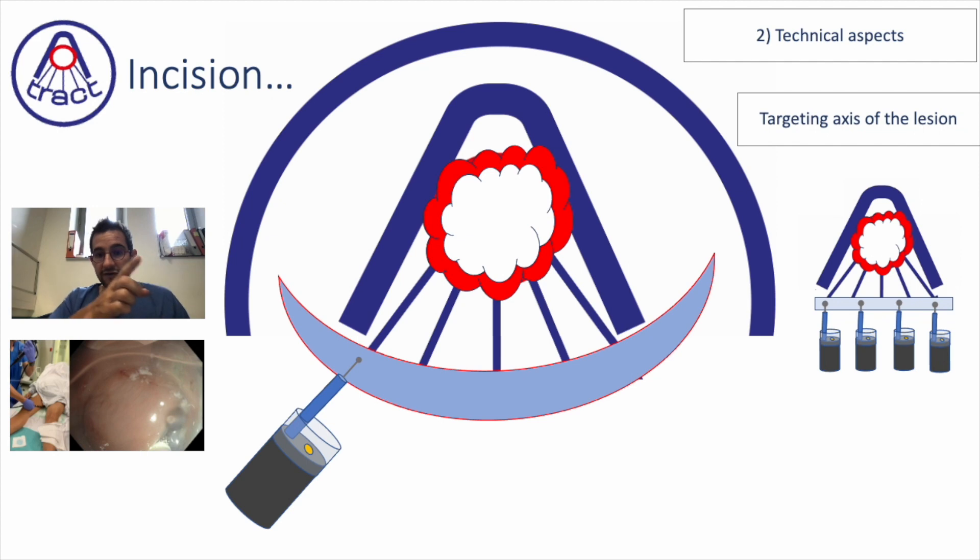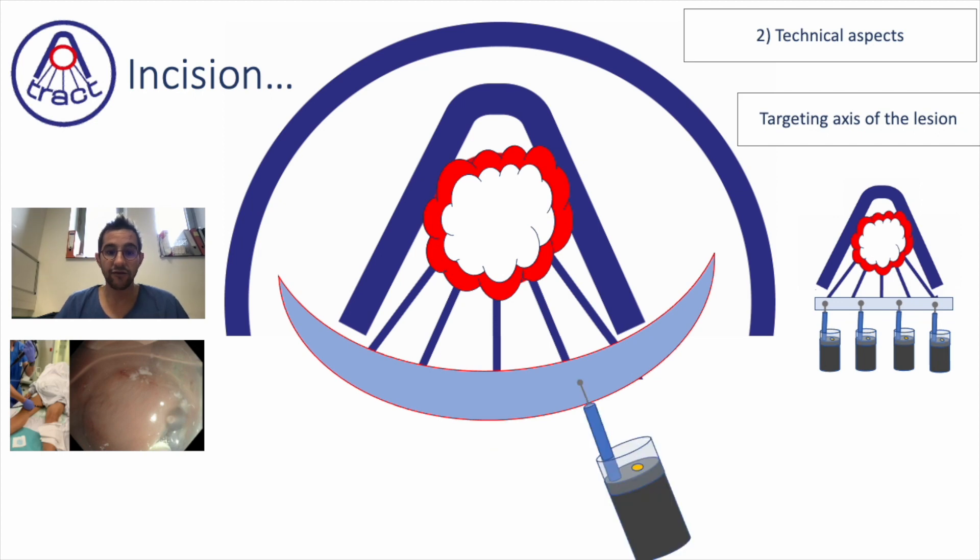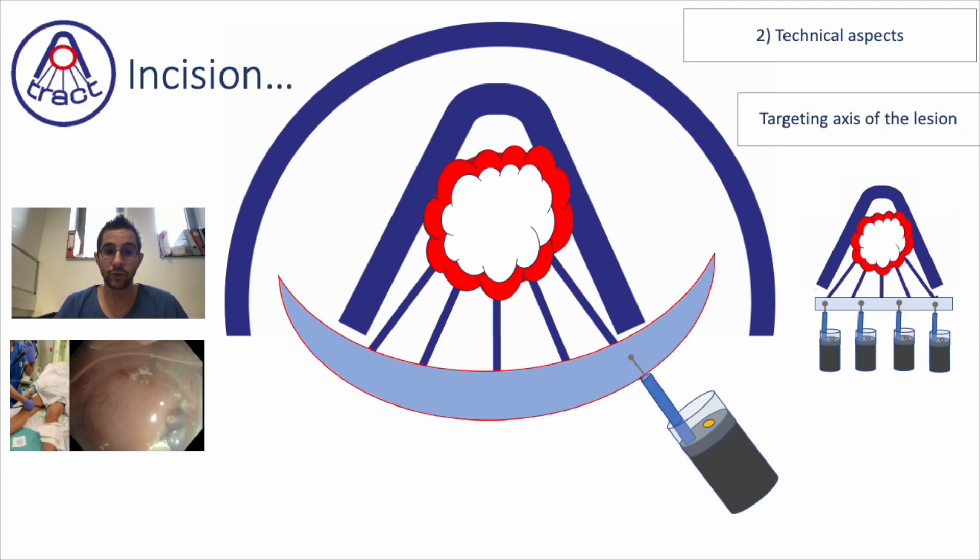The idea is to always follow the line, keeping the scope parallel to the line. If you manage to do this, you will always have an incision and a trimming which goes to the center of the lesion and which participates in the ESD of the lesion.